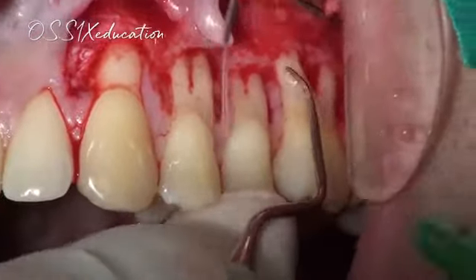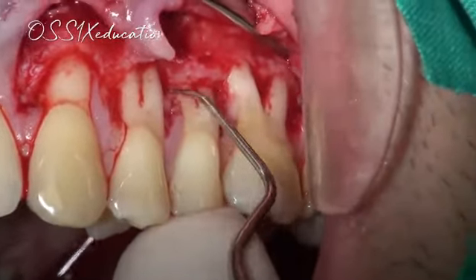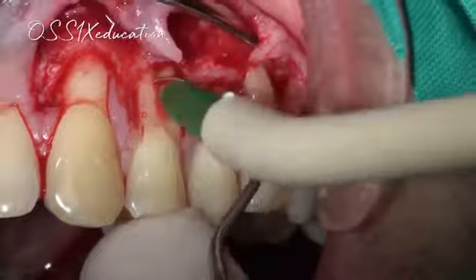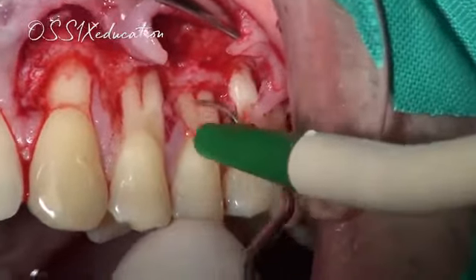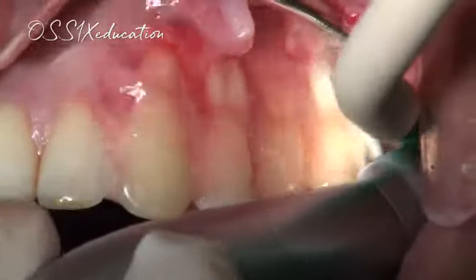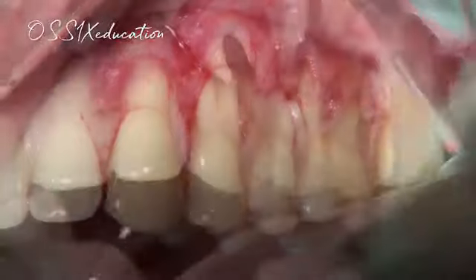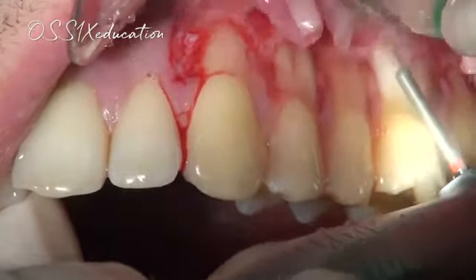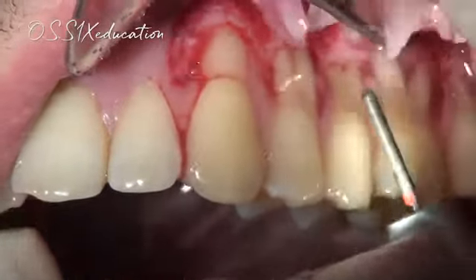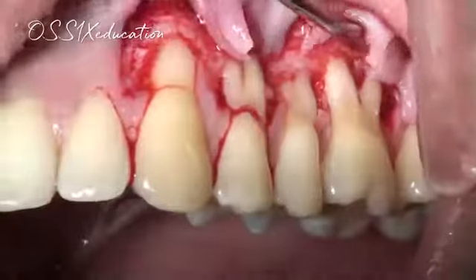I will remove this convexity, sorry. So I will just flatten this root a little bit, not too much, just a little bit. Okay. We continue to scale the root surface. I'm feeling some.